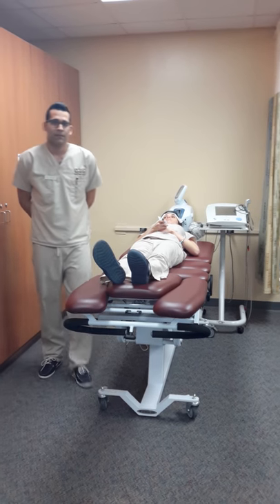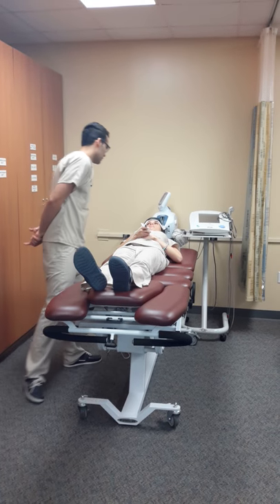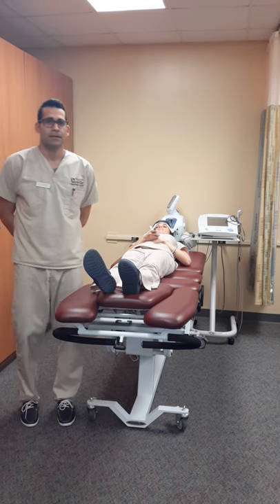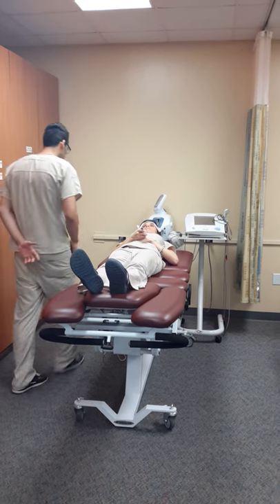So five minutes has passed, so I'm just going to reassess the patient. How are you feeling? I'm good. So now 20 minutes has passed and the treatment is over. I'm going to stop the machine.